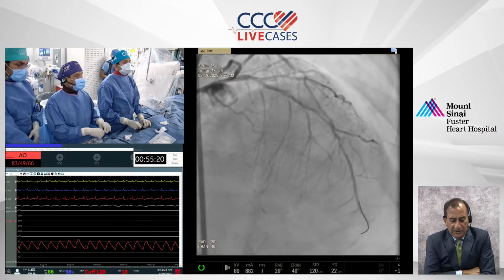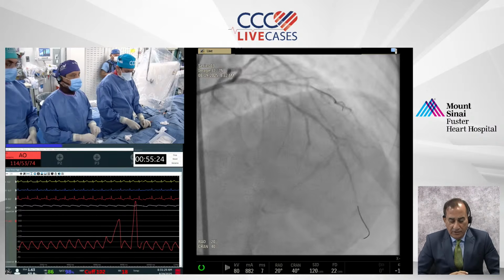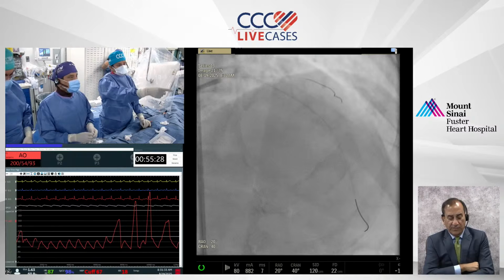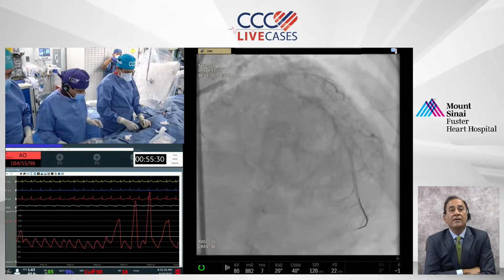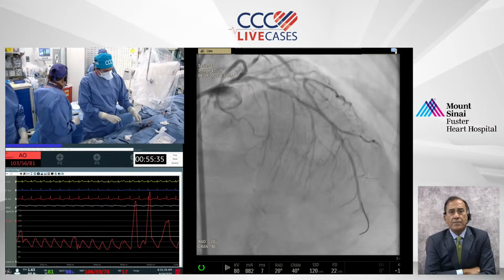He mentioned Aperta is a cutting balloon from Nipro. It's quite good with good trackability. You see there is further disease. It's scoring plus cutting in a same balloon. Open the balloon. 2.5 by 30. Okay.